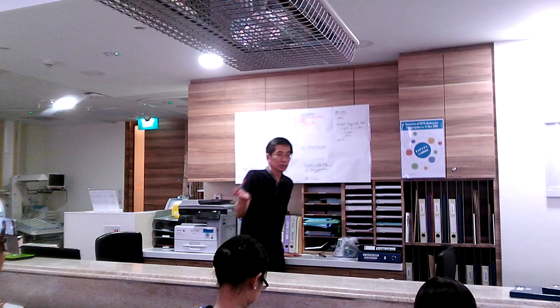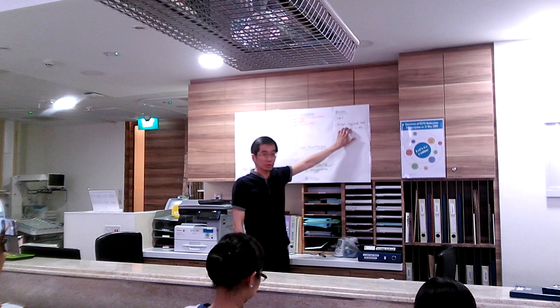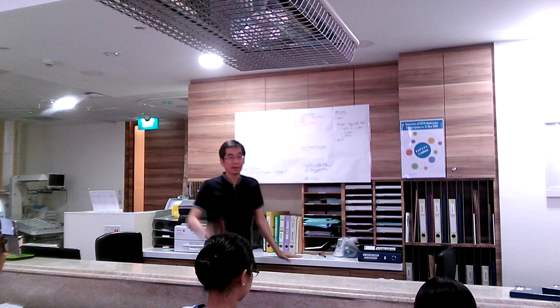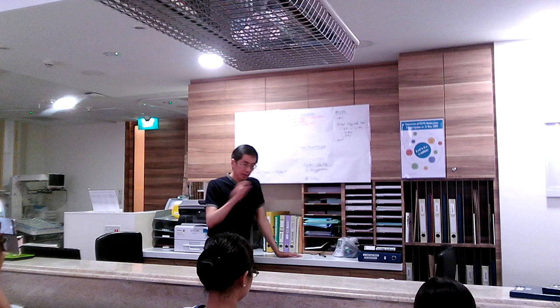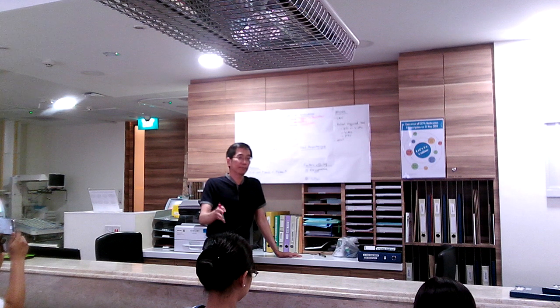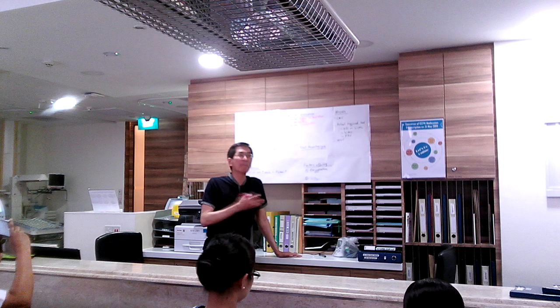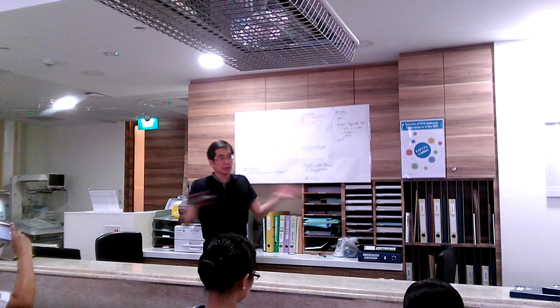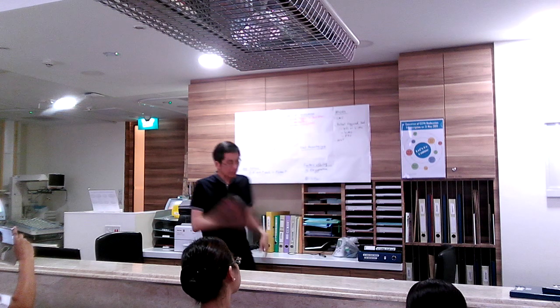So basically, what it means when you put a person on assist control or SIPPV is that the breaths that you have fixed will be given every single time the baby breathes. But of course, you may also put a minimum number. That means you say at least there must be 15 breaths.